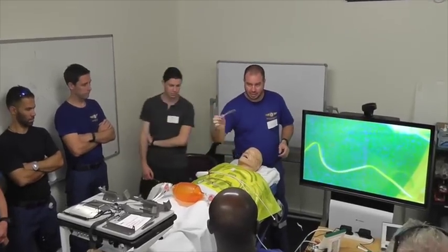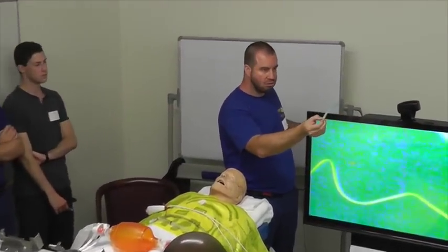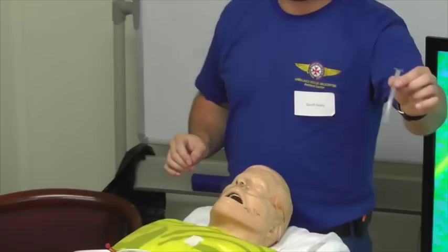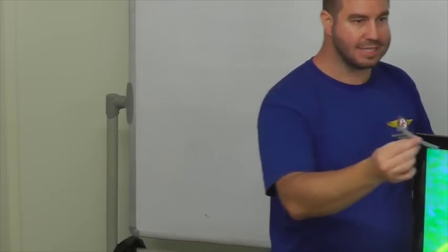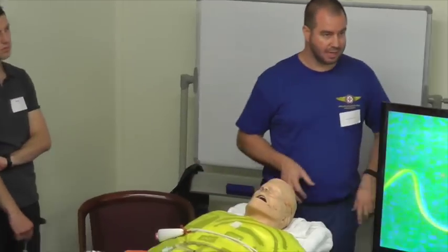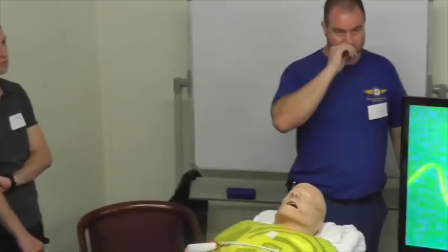Why do I split the nasopharyngeal? So you can remove it in a second. Excellent. Why do I split it in a certain fashion? It's always at 6 o'clock or 12 o'clock in the clock face position. Why is that? Can anyone think? What's in the nose, on one of the walls of the nose, that will poke into my split almost every single time if I don't split at 6 or 12? A nasal turbinate. Almost invariably it will always sit into that split. So it's always 6 and 12.